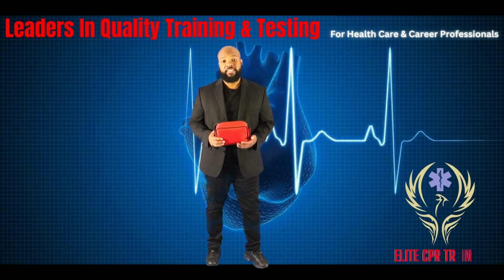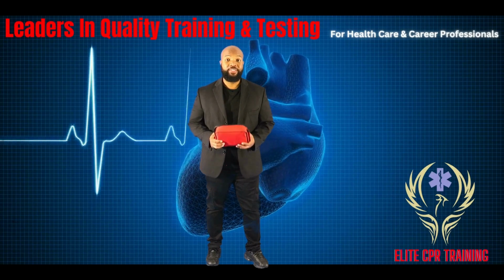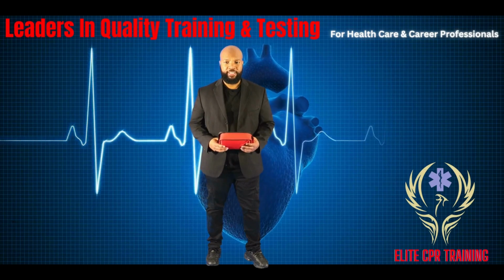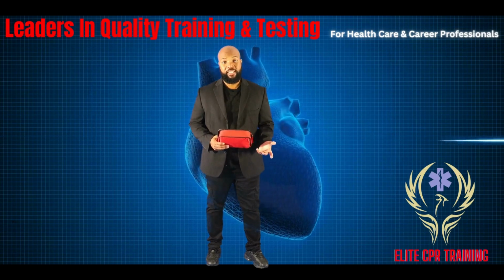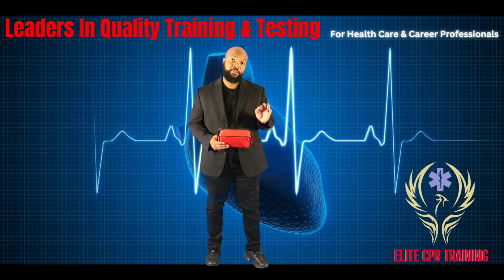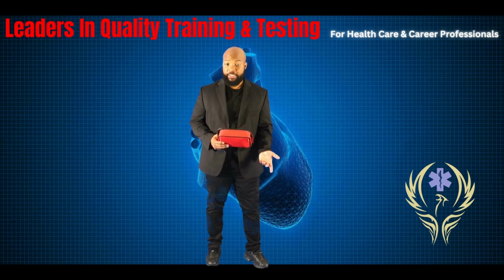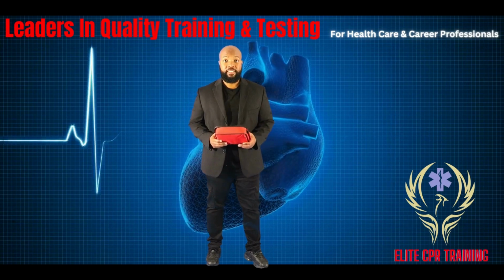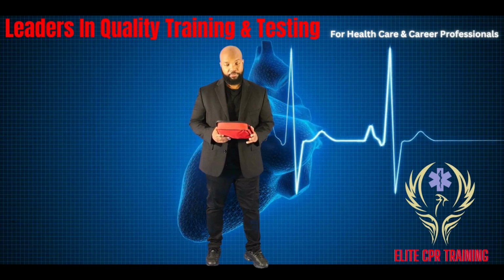Now we're going to go on to the instructional portion of how to use the AED. The AED stands for Automated External Defibrillator. There are different types of AEDs out there, so it's very important that you familiarize yourself with the AED that you're going to use. The universal steps for the AED are as follows.